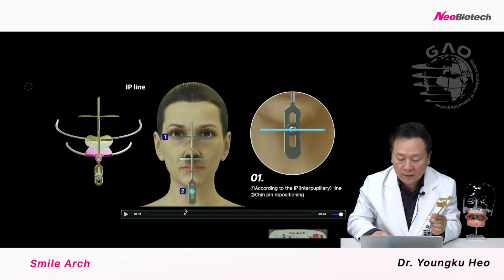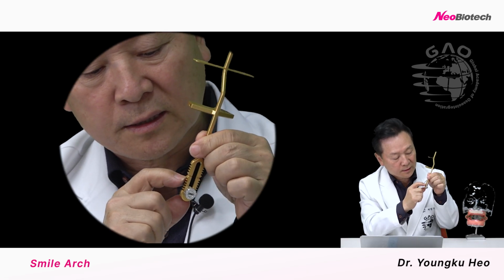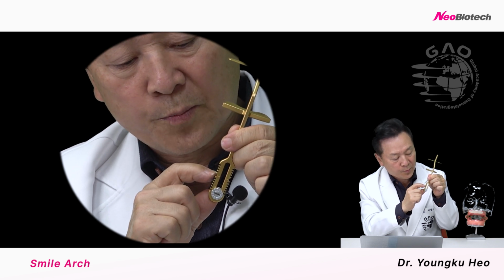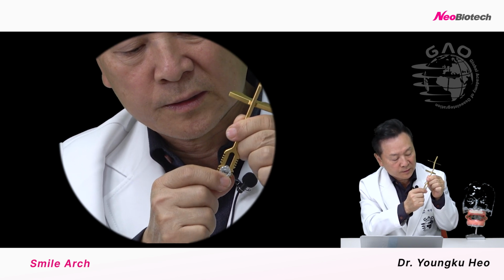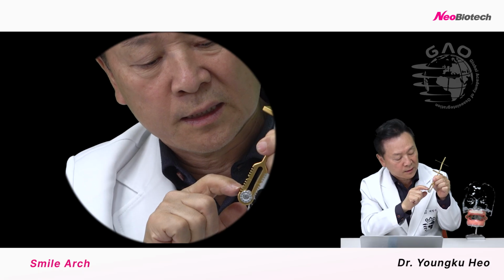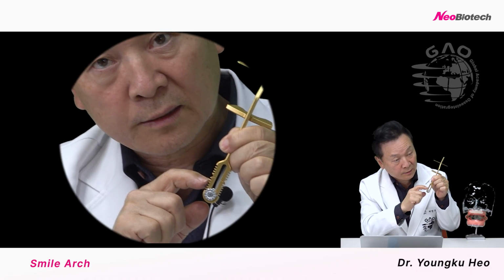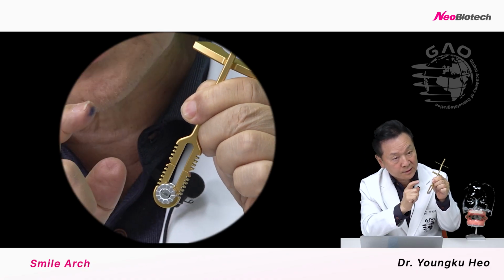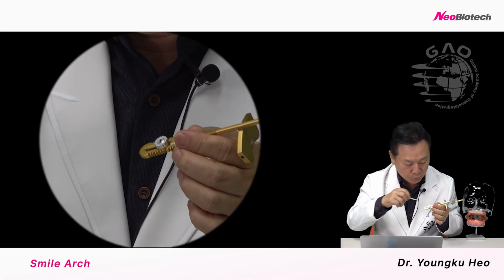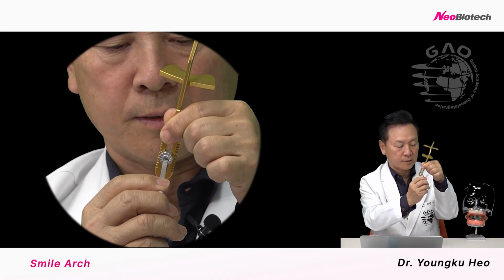So then we can go to D point. There's a line. There's lines 1, 2, 3, 4, 5, and also upper line 1, 2, 3, 4. So if there's 1 millimeter above the standard line, A point, we determine the line below the line as the D point. The D point here is 1 millimeter below the line.